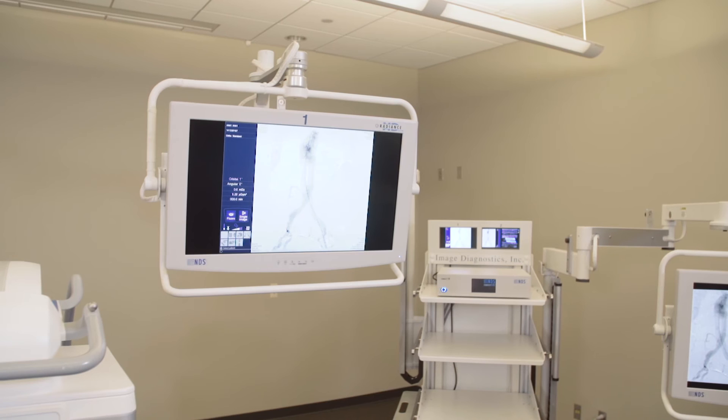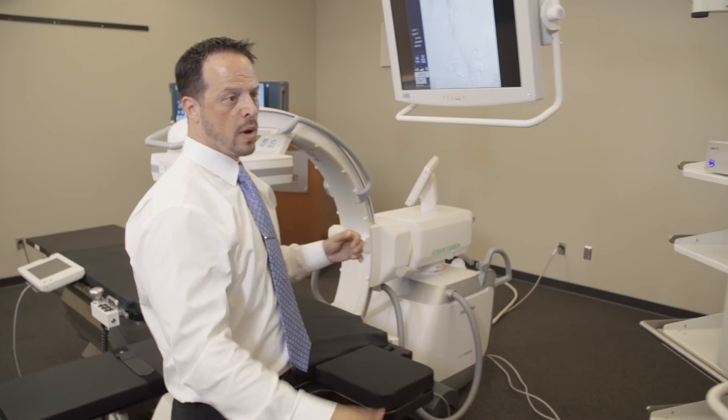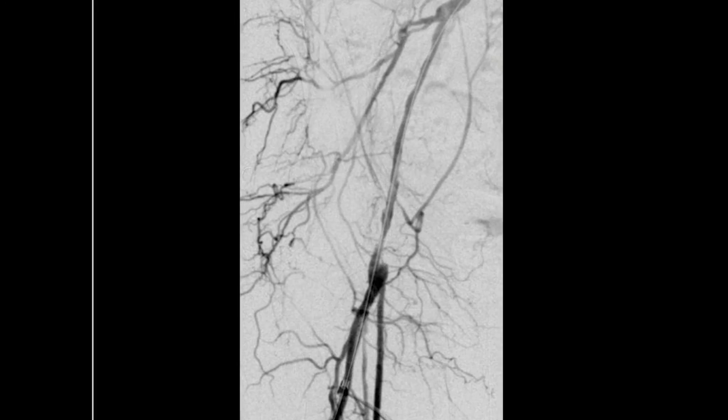Right over here is our IDI monitor trolley. We'll be able to display live images from our C-Arm, as well as any ultrasound procedures going on during the procedure, or any other type of data or previous images that the surgeon would like to compare to as they're doing their live case. Live images being displayed from our C-Arm.